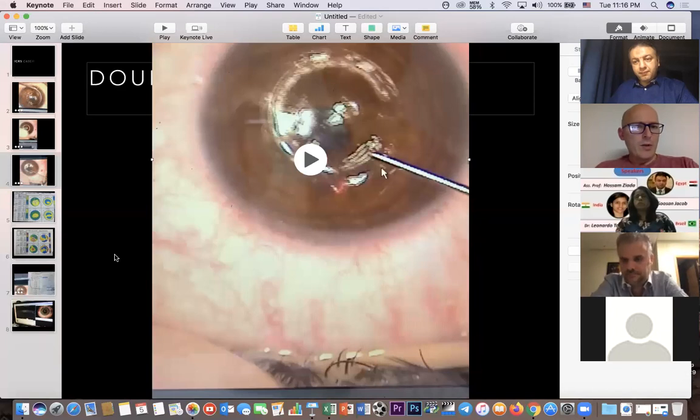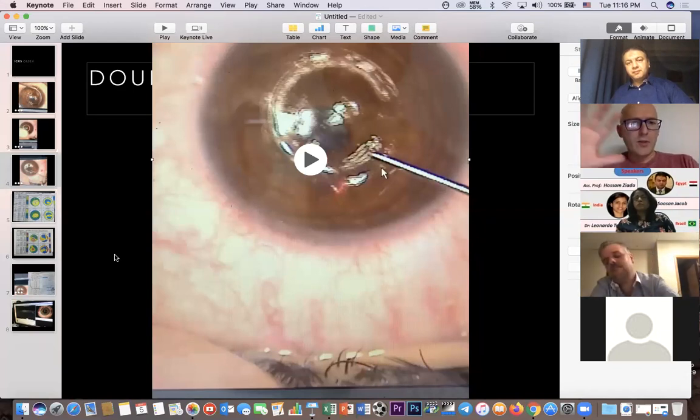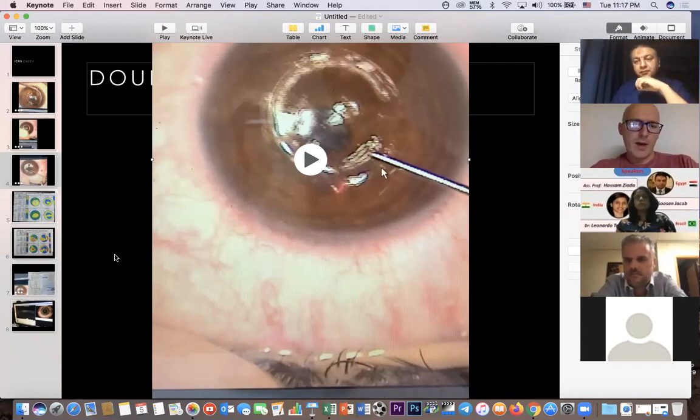Yes, I don't use a nomogram, but usually in the more advanced keratoconus, the more tissue you have to implant. So for the mild keratoconus cases, usually a single segment inferior and temporal is enough. Keratoconus grade 2 to 3 with high astigmatism, usually 2 segments, and the really advanced keratoconus grade 4, a single 320 segment. This is a very superficial way of thinking, but it is. I mean, the more advanced, the more tissue you have to implant to get more flattening effect. Yeah, okay. Perfect. Dr.